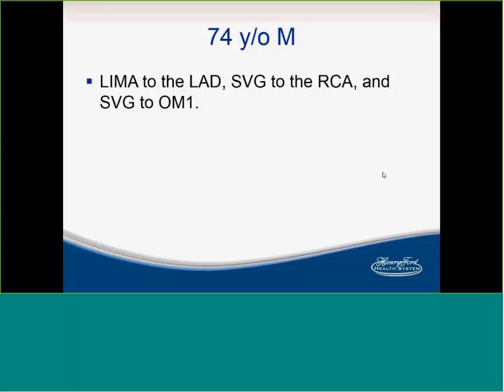Absolutely. If I have to do a subintimal dissection, especially when you do a reverse CART, I'll try to make the reentry right in an occluded segment to preserve all the side branches. You never know; these could be a source of collaterals down the road. And we did show, as Manas showed, an 8.7% CK elevation post-retrograde cases. The Japanese and the J-Proctor registry showed similar results. Probably this is because we have longer tracking and more side branches get lost, so we're trying to minimize that as much as possible.